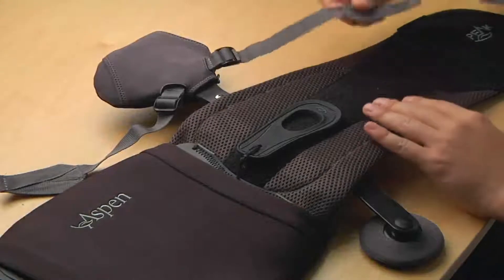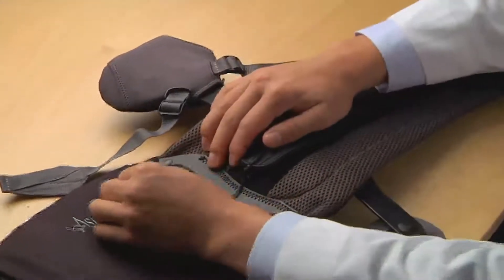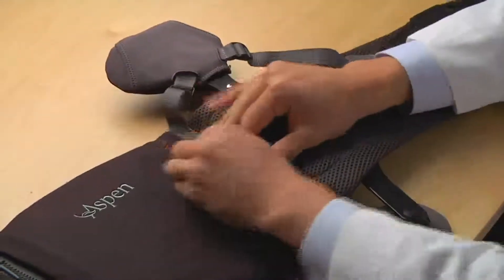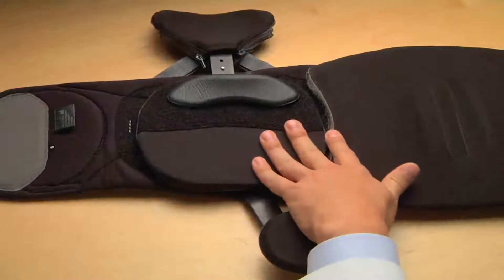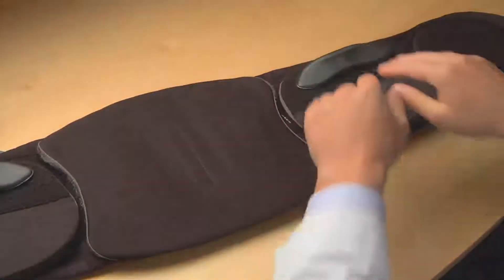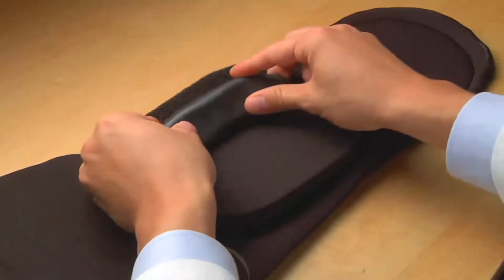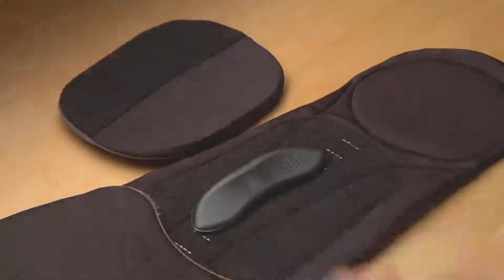Attach the anterior tension strap as shown and press down to secure. The posterior tension strap connects to the loop material on the tightening mechanism as shown. Do not tighten the straps at this time. Apply the lateral panel with the iliac pad to match the location on the opposite side and press down to secure. Note that iliac pads can be repositioned on the lateral panels or placed directly on the belt to accommodate patient comfort.